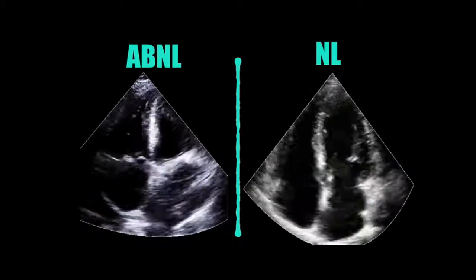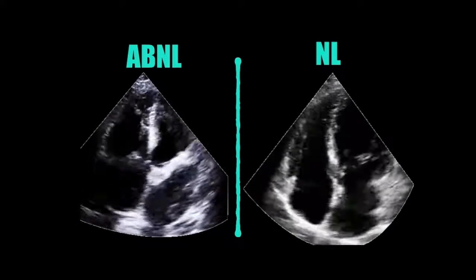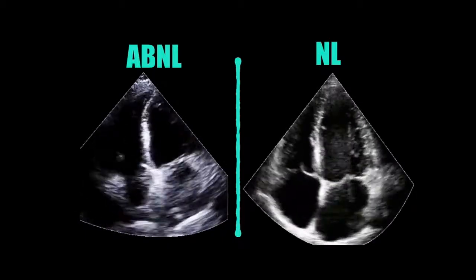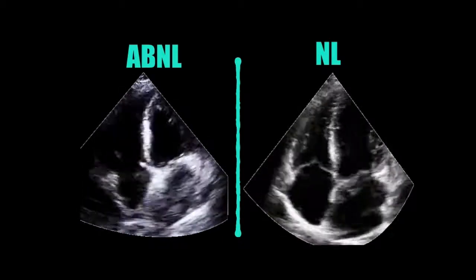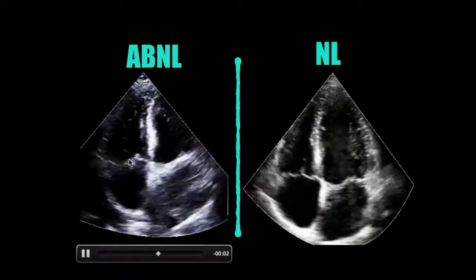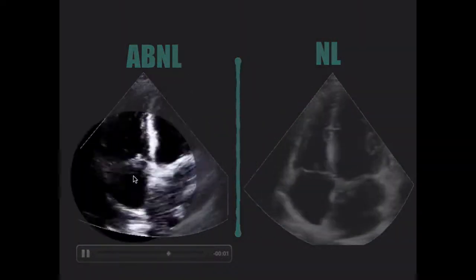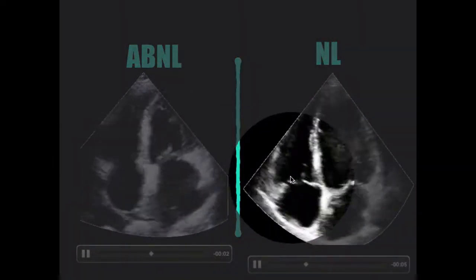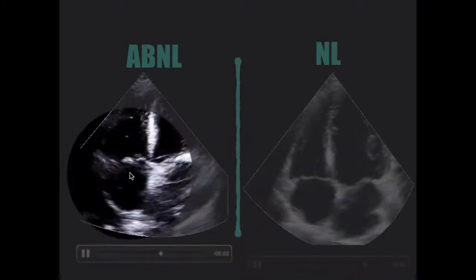We have a normal on this side and abnormal on the left. Can you tell me which valve is abnormal? Look for a little booger — a little valve booger. See that guy right there? It's a very small vegetation on that tricuspid valve. This is what normal looks like — no little booger on this tricuspid valve. A little tiny booger on that tricuspid valve: this is endocarditis.